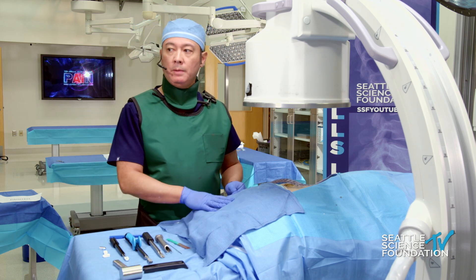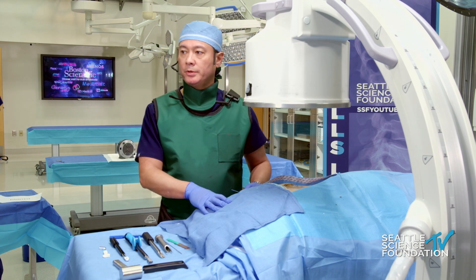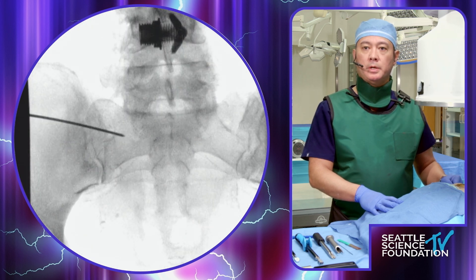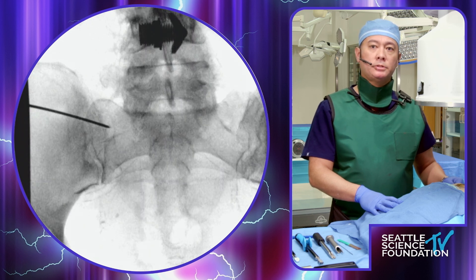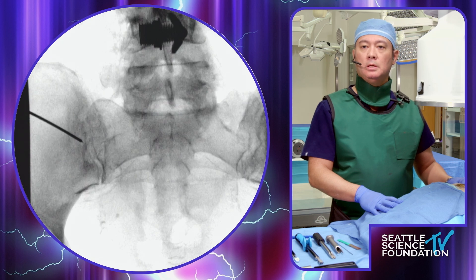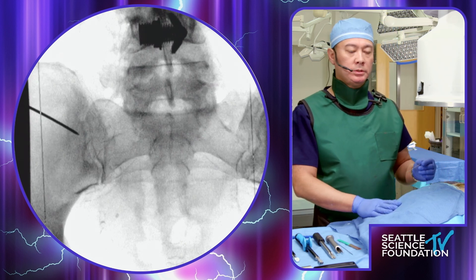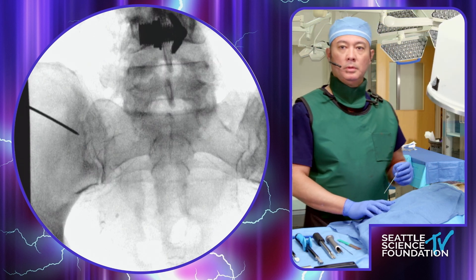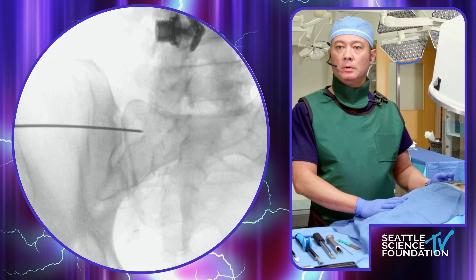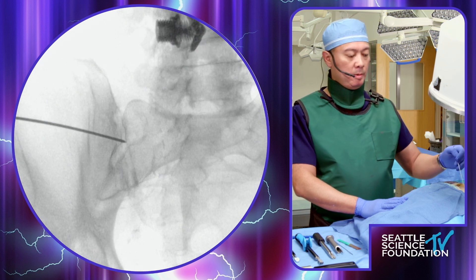Let's now move to the cadaver and have an AP view here — can you guys see that on your monitors? Excellent. We're doing anatomic mapping at the PSIS, looking at the anterior portion of the joint. We're going to line up that joint in a more contralateral oblique view — let's go oblique towards you, approximately 25 degrees. For this procedure we're looking at the mid-third portion of the joint.